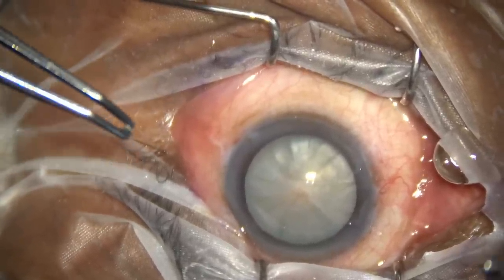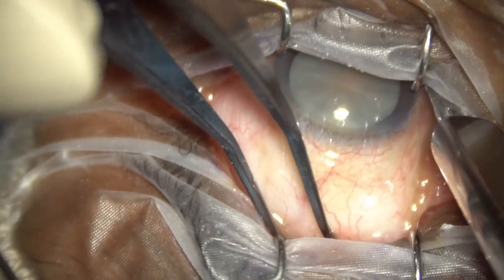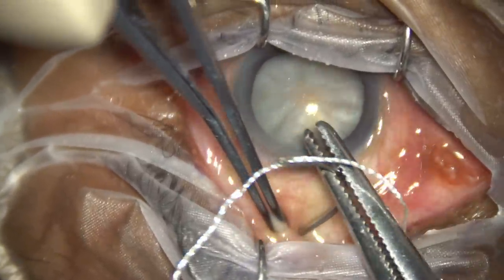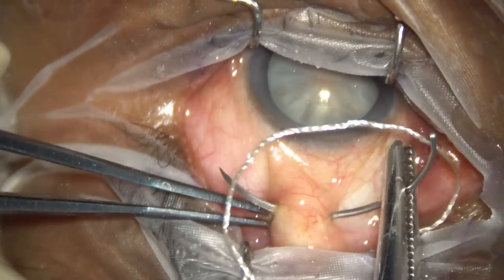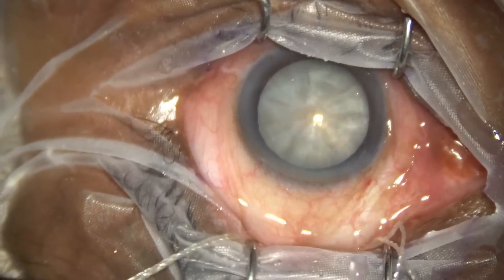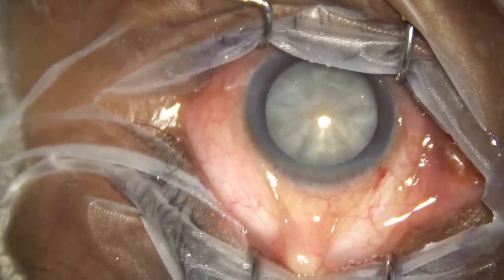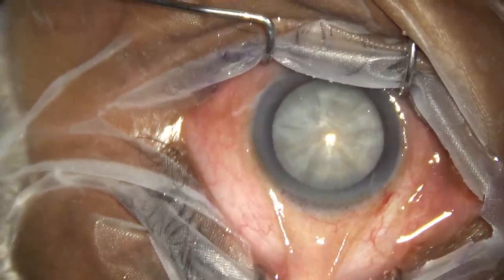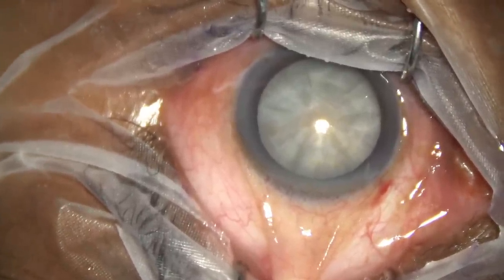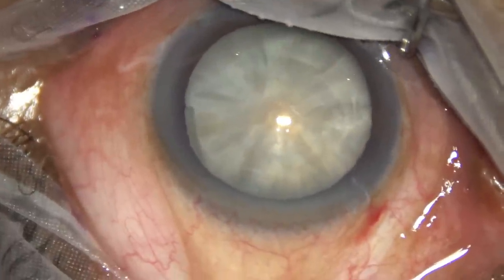So I am placing a superior rectus bridle suture. For that, the eyeball is turned down by this muscle hook. The superior rectus tendon is held nicely, and a thick suture is passed under the tendon. Now the eyeball is stable, and peritomy, tunnel making, all those steps will be easier in comparison to if the superior rectus bridle suture is not applied.